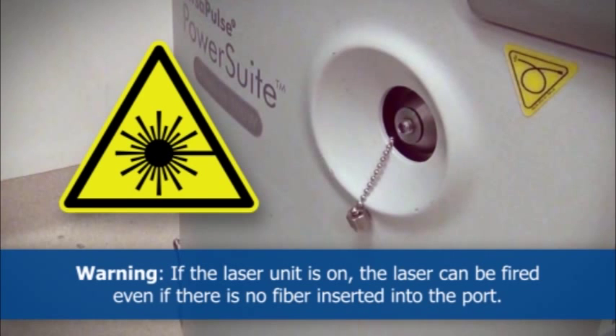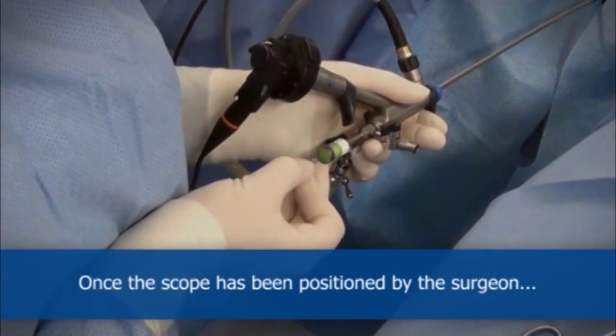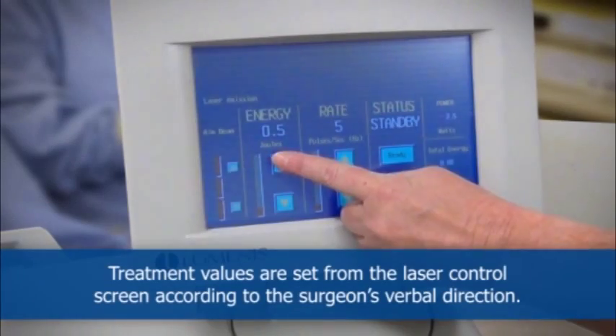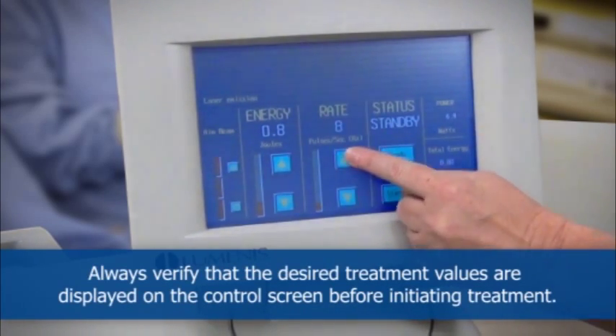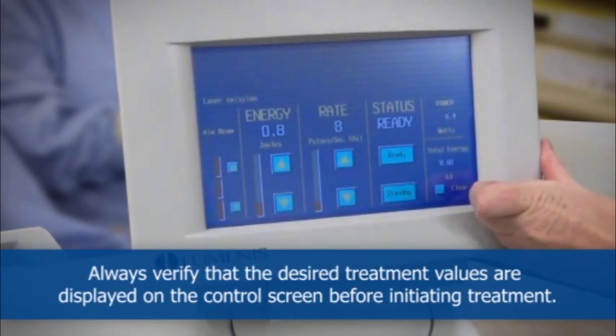If the laser unit is on, the laser can be fired even if there is no fiber inserted into the port. Once the scope has been positioned by the surgeon, the fiber tip is inserted through the working channel of the scope. Treatment values are set from the laser control screen according to the surgeon's verbal direction. Always verify that the desired treatment values are displayed on the control screen before initiating treatment.